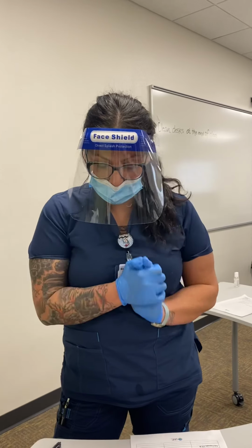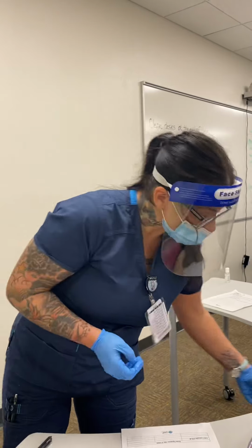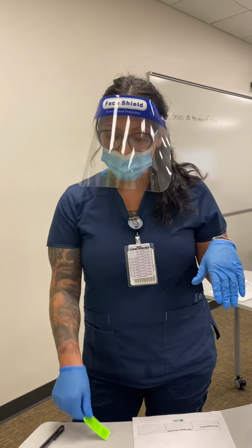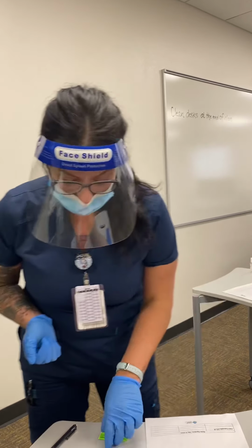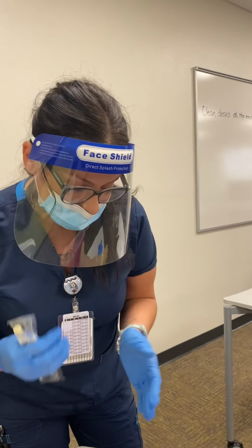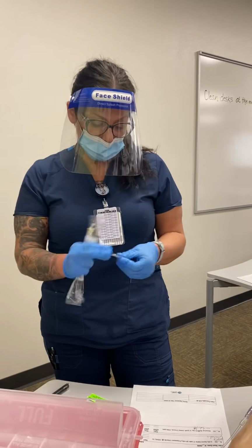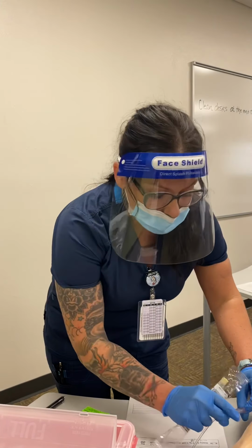Now I need to just go ahead and document everything that I've started and how the patient tolerated it, site assessment. I'm going to be back in about 15 minutes to reassess her pain. Okay, I would exit the room, do all the hand hygiene stuff, and it's 2 hours later, so I need to come back in because the meds are done. So I would again identify my patient, name, date of birth, all that good stuff. Don gloves after washing my hands, confirming allergies. So now I need to go ahead and turn off my pump.